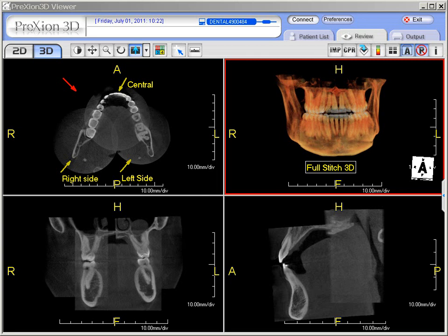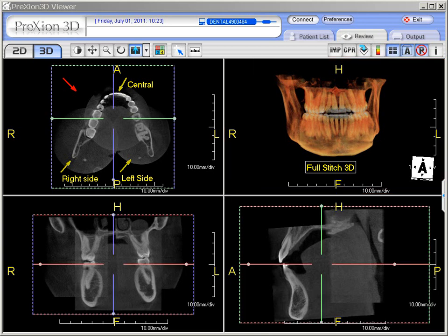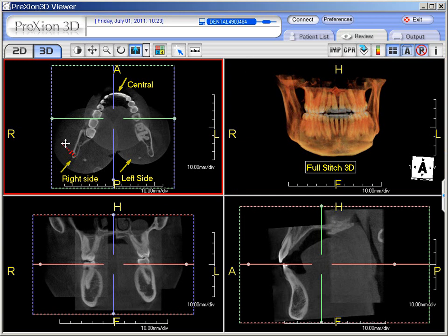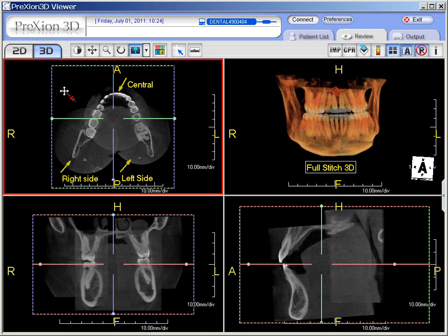Hello, this video is a brief overview of the Prexian 3D fusion and stitching features, combining multiple cone beam data sets into one. In this example, we have taken three cone beam data sets — a right, a central, and a left — combined from three separate scans and fused and stitched together. So we have the axial, coronal, sagittal, and the 3D all fused and stitched together.